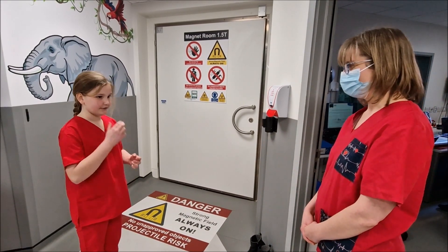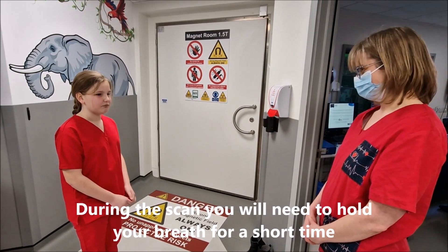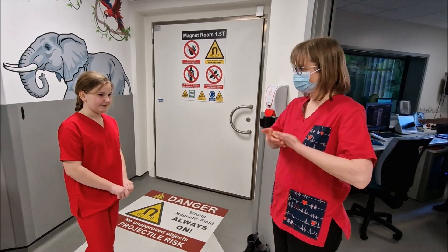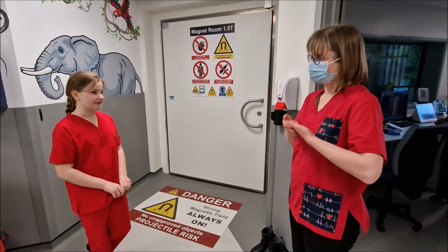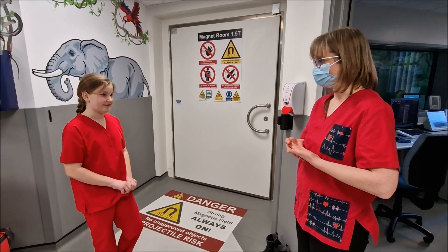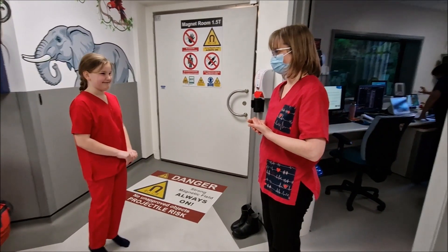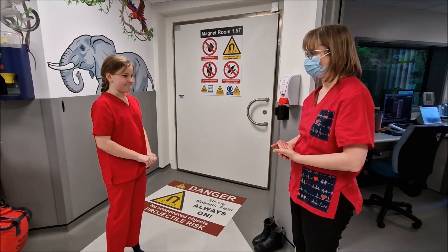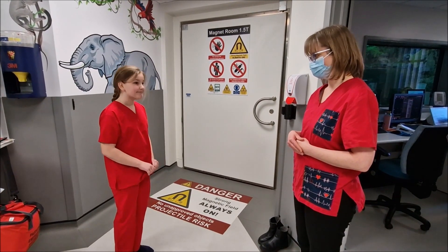Do you remember why we ask you to hold your breath during the MRI scan? So you can get a better picture? Correct — because as we breathe, our heart moves up and down. If the heart moves when we try to take the picture, it's a bit like when you're on a trampoline and we get all blurry pictures. So we ask you to hold your breath: breathe in, breathe out, and then stop breathing just there, and then we get some beautiful pictures.